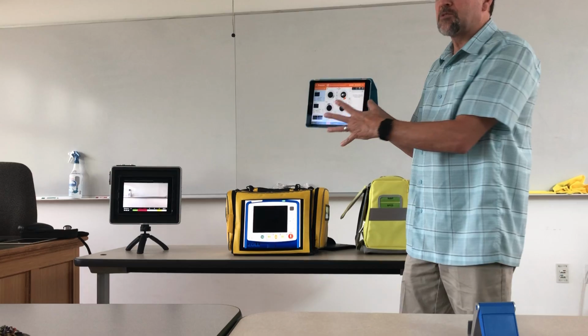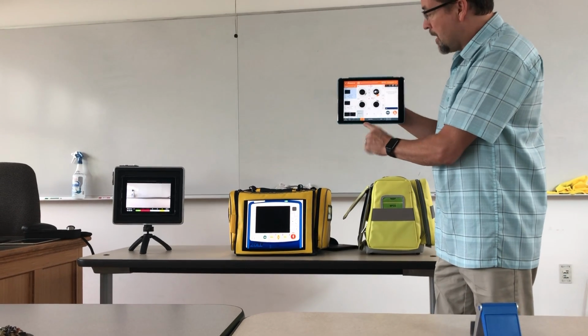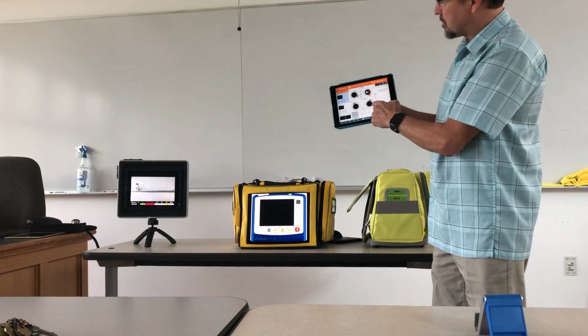So I apologize for it being small. That's why I was hoping I could project it up there so you could see the controls a little better. So start button's flashing yellow here down at the bottom. And you hit the start button, and you'll notice that I've got a bunch of parameters set here.